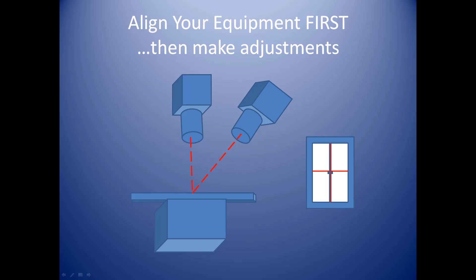You also want to make sure that you are aligning your tube with your table. All these exams are done on the patient examination table, not at the upright bucky, so you want to make sure that you are aligning your overhead tube to the table. The collimator field should indicate the film area located underneath the table. If you don't have a DR system that is automated, you'll want to insert your cassette into the system and have it ready before the patient comes in.